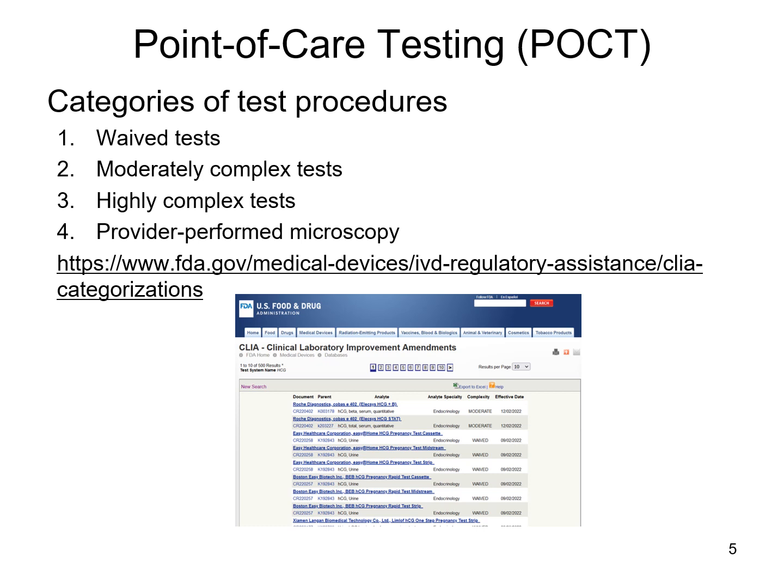So you need more specialized education and training to perform some of those high complexity tests. So moderate complexity testing is usually, most of it's just putting the samples on the analyzer and running it, whereas high complexity testing would be things like microscopic work or identifying bacteria, blood bank testing, things like that.